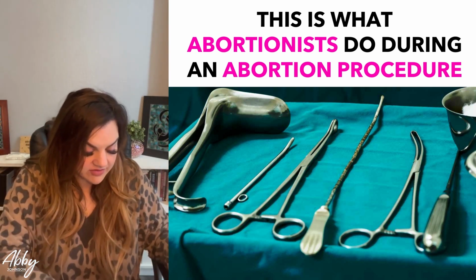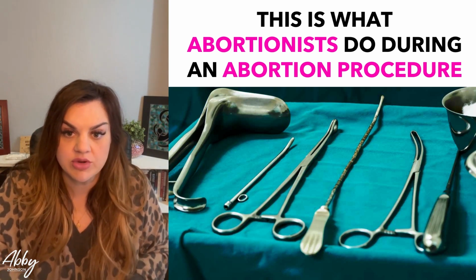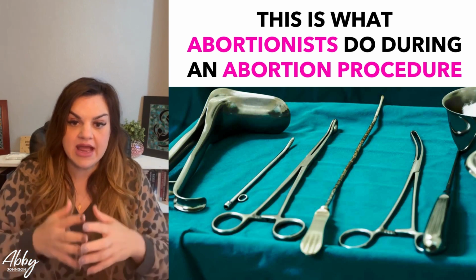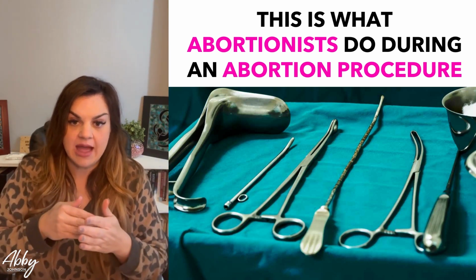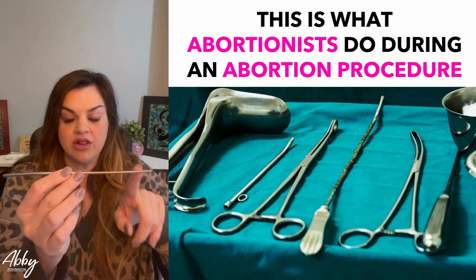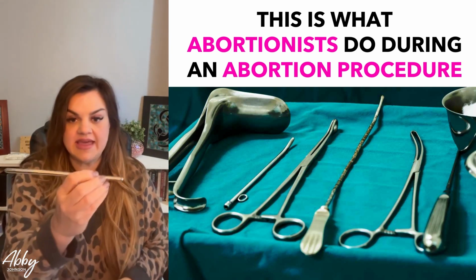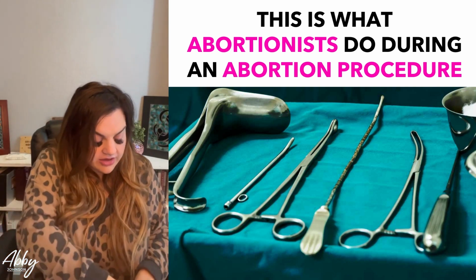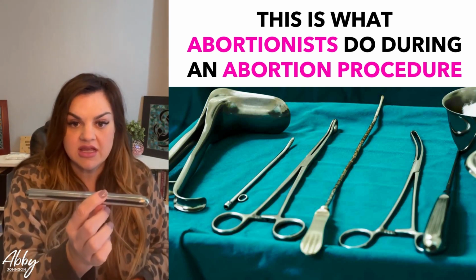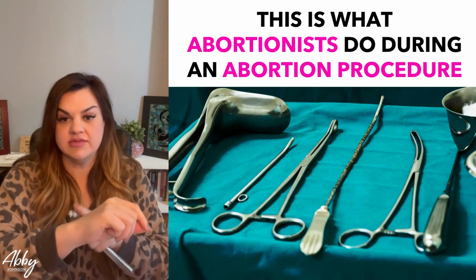And I have a pack of those here. And so I'll just sort of show you. This is probably one of the most uncomfortable parts of the abortion procedure itself. And so they're dilating the cervix unnaturally. So what would naturally happen during childbirth, they are forcing this to happen through these metal dilation rods. So they're graduated, and you can see that this side is smaller than this side. And this is the smallest dilation rod, but they get larger and larger and larger, and you can see that. So this one's larger than the one I just pulled out, and then they get larger and larger. This is the largest one in this particular case, but they get much larger than this. They can actually get about the size of my wrist.